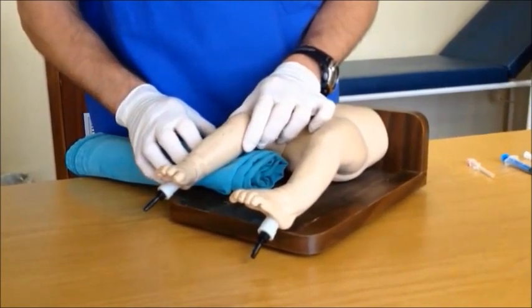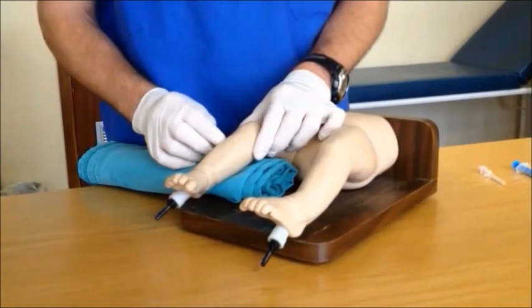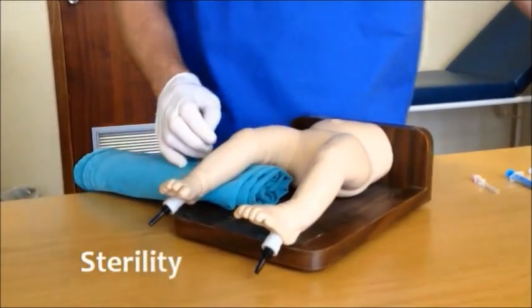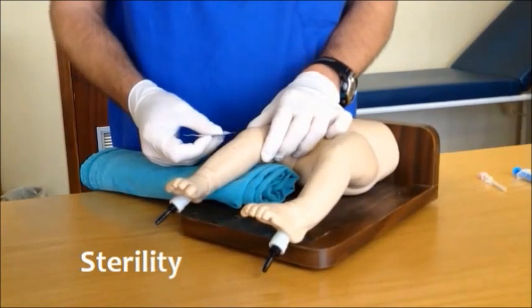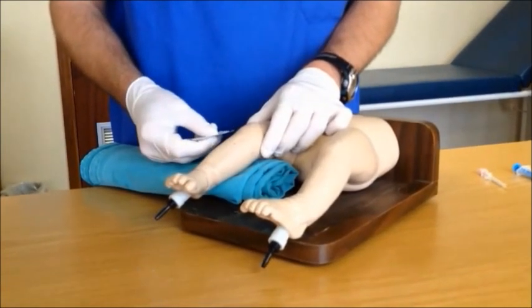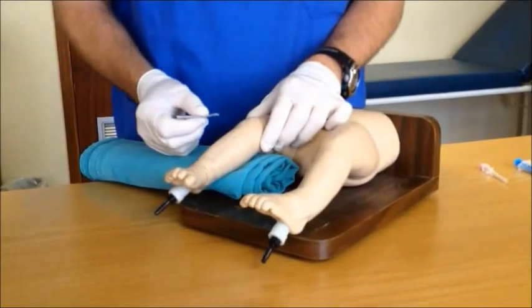Once the child is correctly positioned and the area of insertion has been identified, proceed with your procedure. Although this is an emergency and sterility is often not possible, attempt to be as clean as possible — an alcohol swab beneath the leg is the absolute minimum.